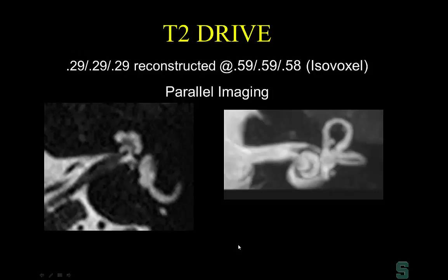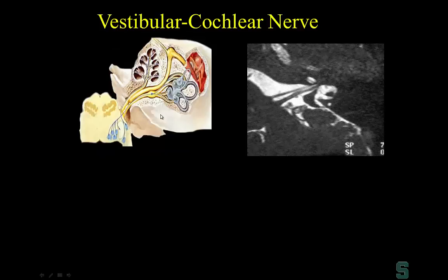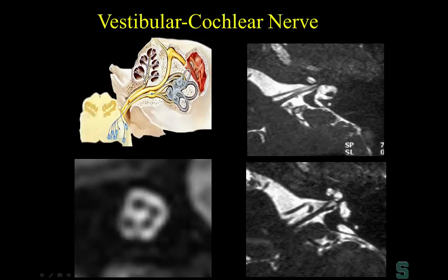We now routinely perform heavily T2-weighted imaging through the internal auditory canal, and the anatomy is very nicely seen. There are four nerves in the IAC — remember 'seven up, Coke down.' The seventh nerve is anterior and superior, so here's the facial nerve at its labyrinthine segment, anterior genu, and geniculate ganglion, seen on the heavily T2-weighted images.